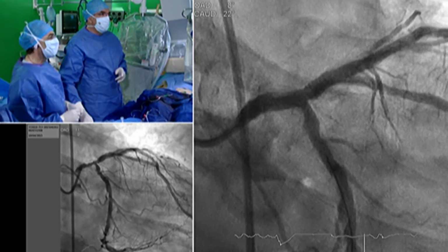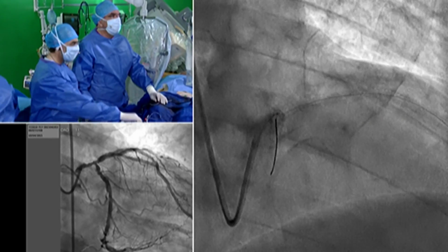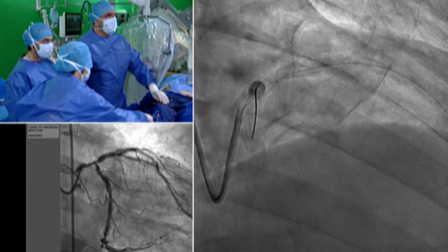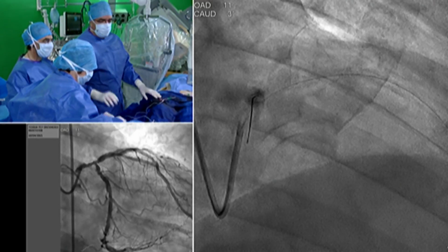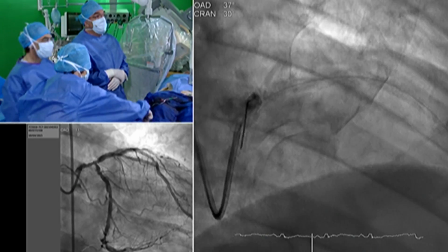The problem will be to be sure that we have not, we took a 38, but is there any gap between both stents? We need another point on the LAD. We're injecting now. Yeah, certainly there is some gap in between.